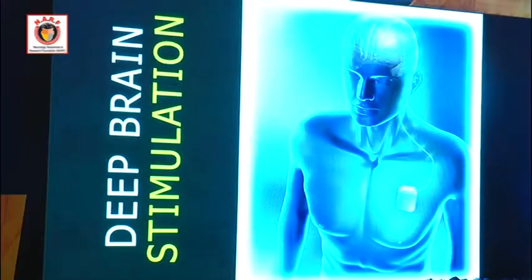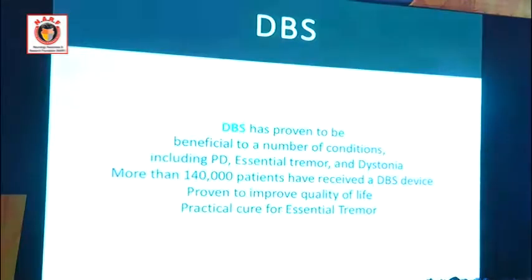6,566 to be close to be accurate. Combination possible. That's why you have to have algorithms. You have to have an idea of what's going to affect what, what does voltage do, before you can select the right technology, right setting. And that's where the programming lecture will come in today.